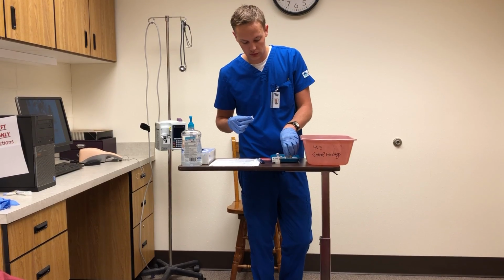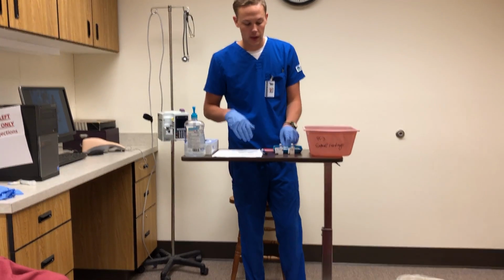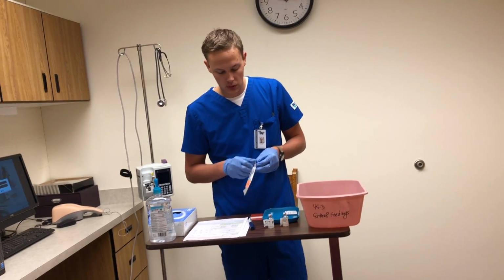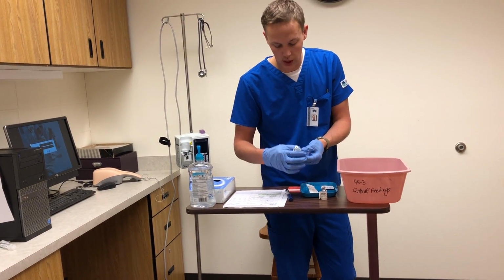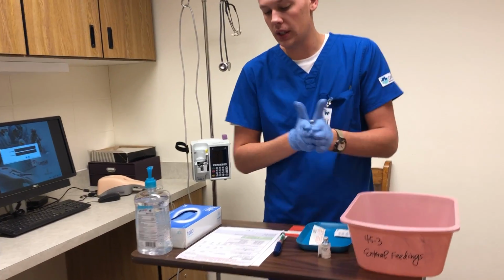Okay. So those are sterile and ready to go, and as long as I don't turn my back on them, they'll be fine. So then I know that I'm going to be drawing them up into the same needle, and so I forgot to mix them, so I'm going to have to mix them.